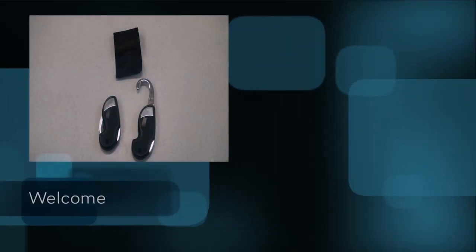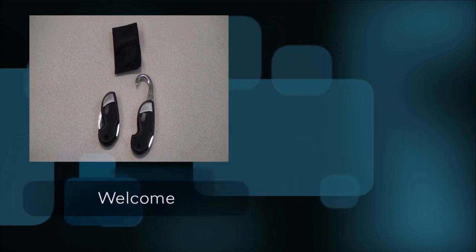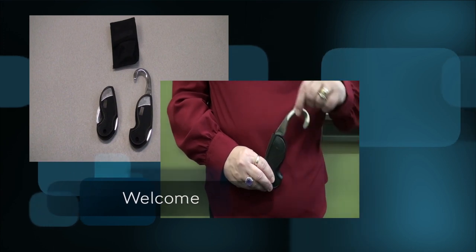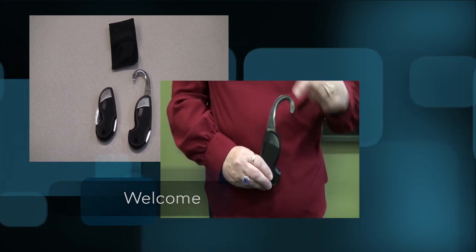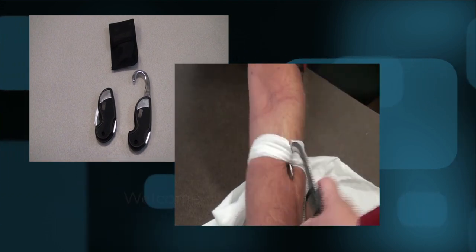Welcome to the 9-1-1 Rescue Knife presentation. We will show you the proper use of the 9-1-1 rescue knife. Each workplace will have policies and procedures in place regarding issuing, carrying, controlling, recording, and use of the emergency 9-1-1 rescue knives.